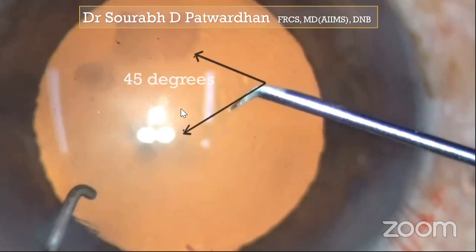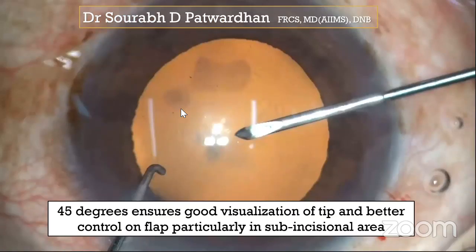Now the tip has to be bent exactly 45 degrees. Why exactly 45 degrees? Because when the tip is bent 45 degrees, it gives good visualization of the tip, so you know where you are holding the flap. Particularly in the subincisional area, it is of use because you are actually seeing where you are holding the flap. If it is bent too much, then you don't have proper visualization. And if it is bent less, you don't have proper control over the capsulorhexis edge.